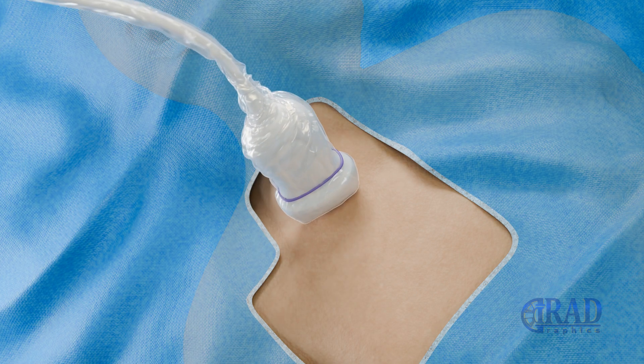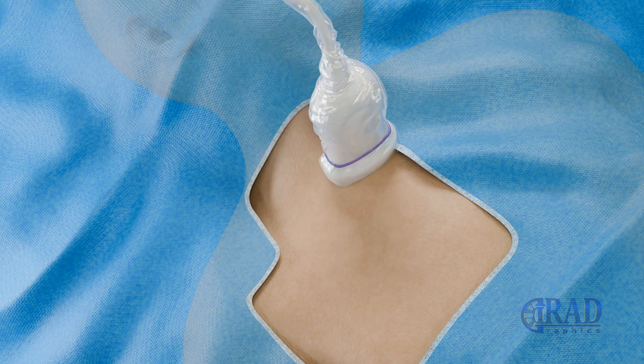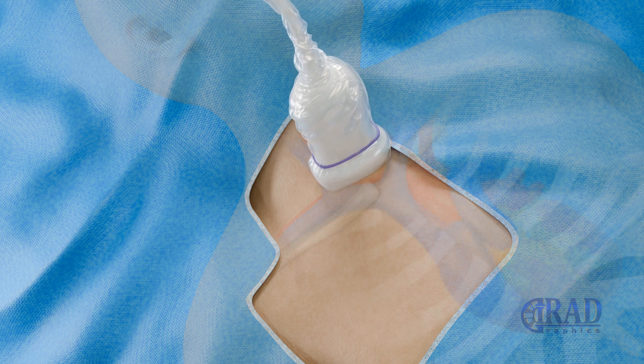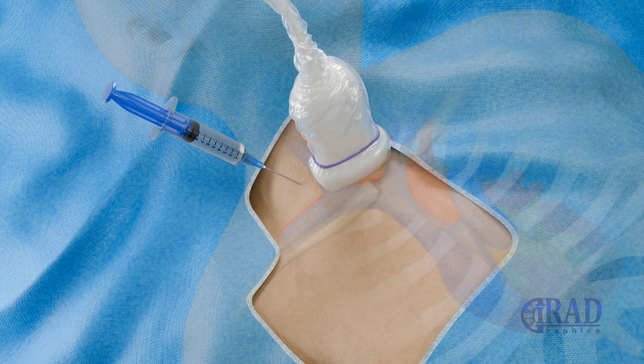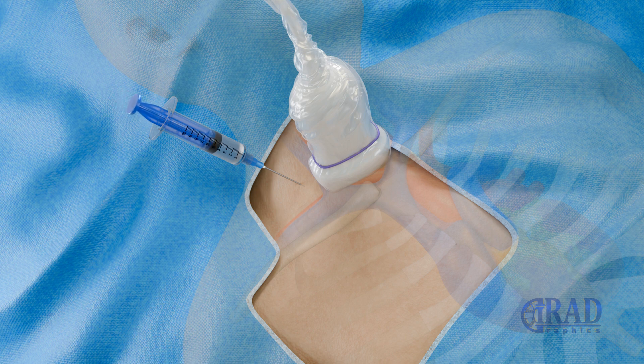Using real-time ultrasound guidance, the internal jugular or subclavian vein is identified. After finding the access site, local anesthesia is administered to numb the access site.